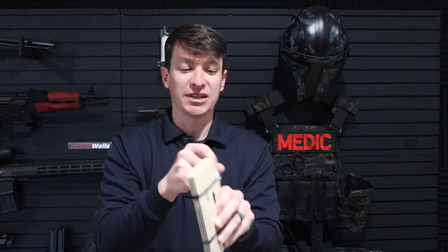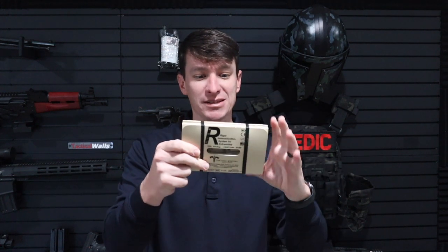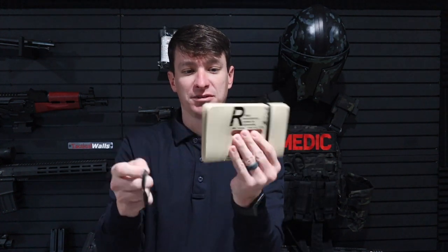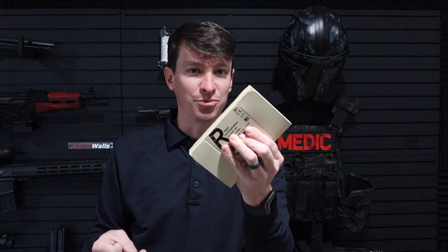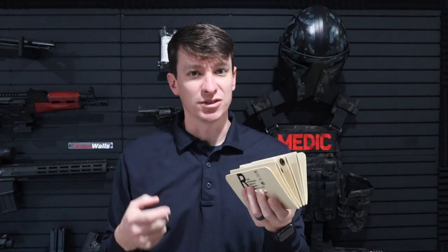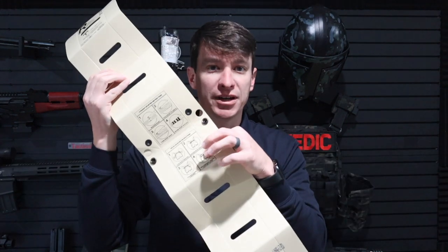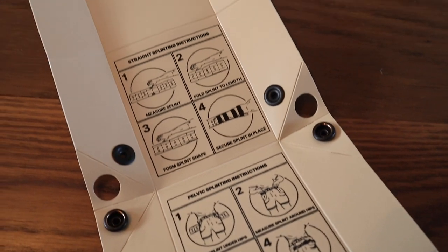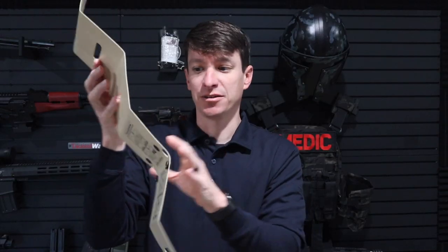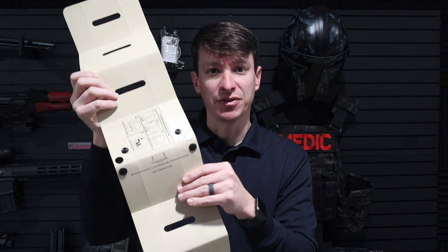I would recommend taking this thing out of the plastic ahead of time, because if my hands are bloody or I have gloves on, this could become a pain. It has rubber bands here to keep it nice and secure, which is helpful. When I posted the picture on my Instagram page, some people were questioning whether this was cardboard — it's not. This is a hard plastic here. It has directions for making a straight splint, using it as a pelvic binder, and also making a 90-degree turn for an elbow or an ankle.